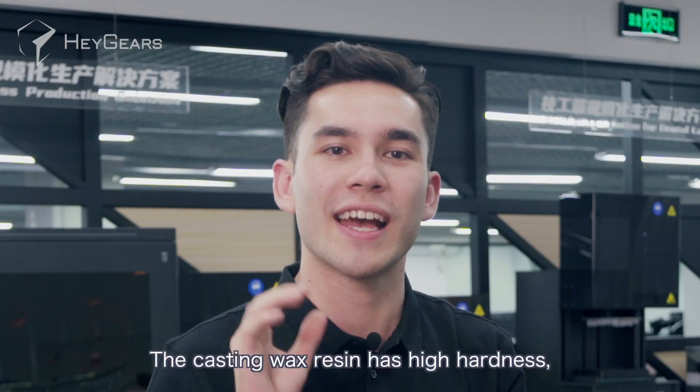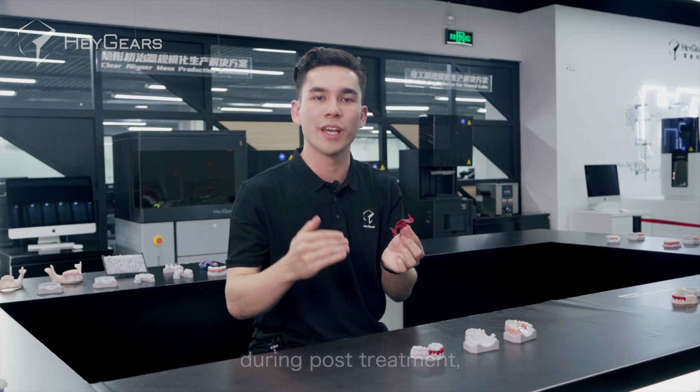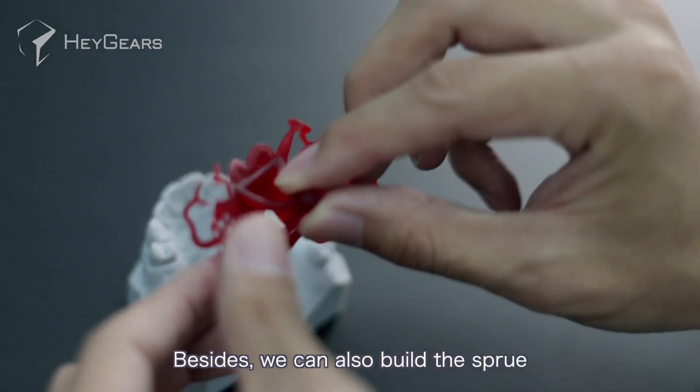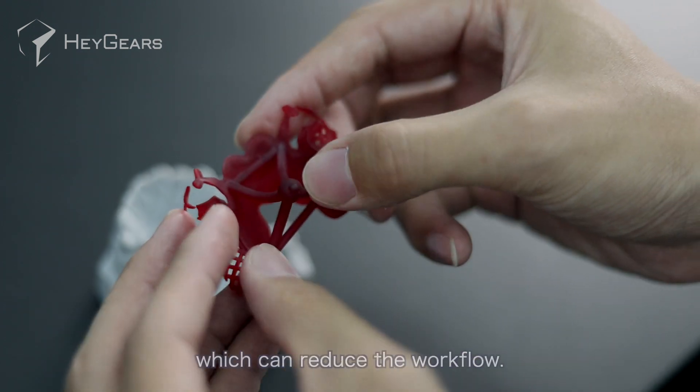The casting wax resin has a high hardness that can prevent the wax model from deforming during post-treatment, while constructing the sprue and other procedures. Besides, we can also build the sprue while designing the framework, which can reduce the workflow.